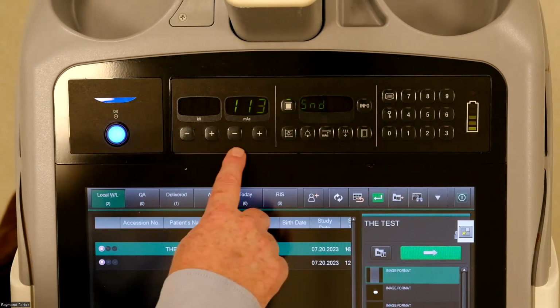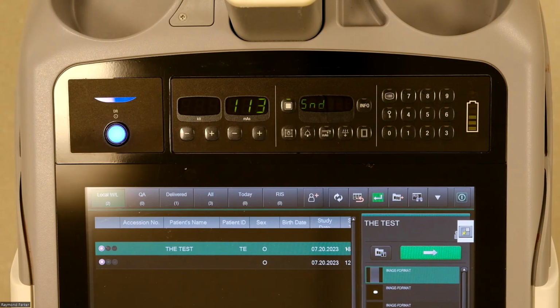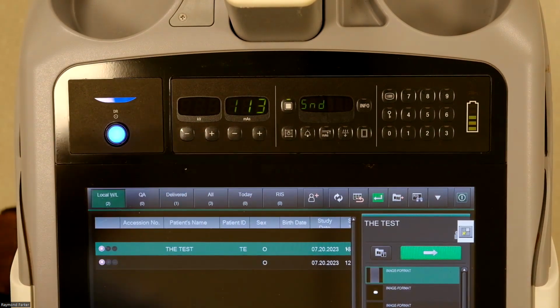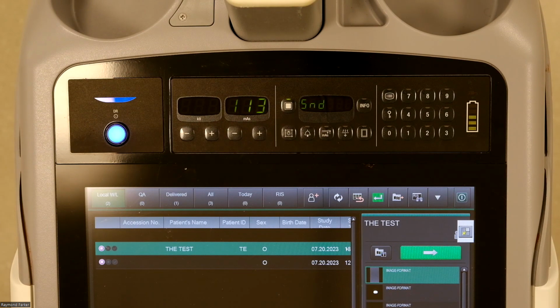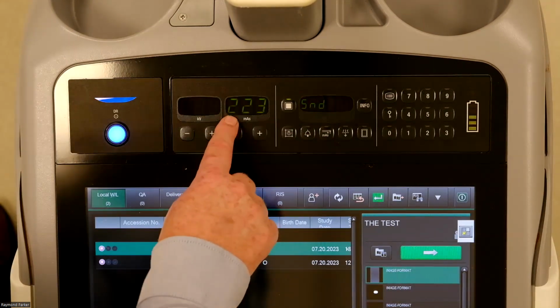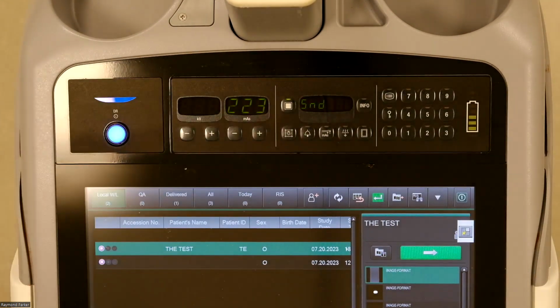For sounds, in the operation manual and the service utility or service manual, there are some conversations on your sounds. From an applications perspective, usually I do not touch the entry here, 1 or 2. 1 is your exposure sound, 2 is your prep sound.